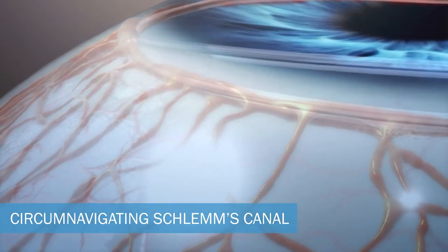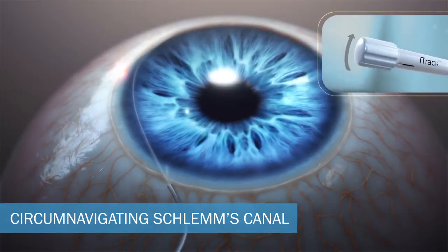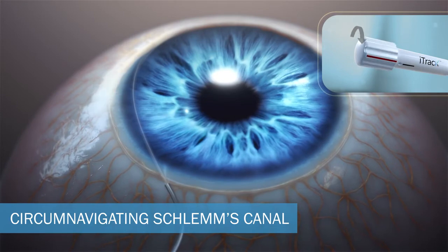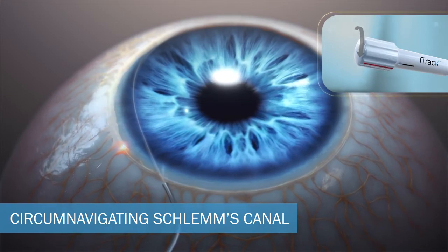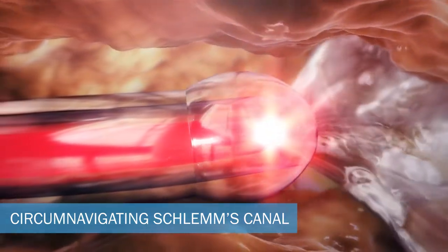Once the EyeTrack has navigated 360 degrees of Schlemm's canal, it is slowly withdrawn. The technician will give approximately 9 clicks of viscoelastic per quadrant with the viscoinjector, as instructed by the surgeon.